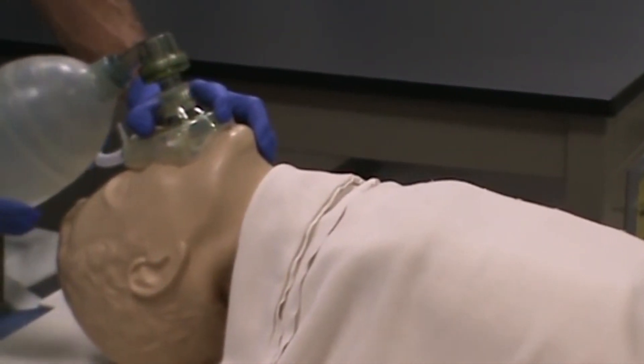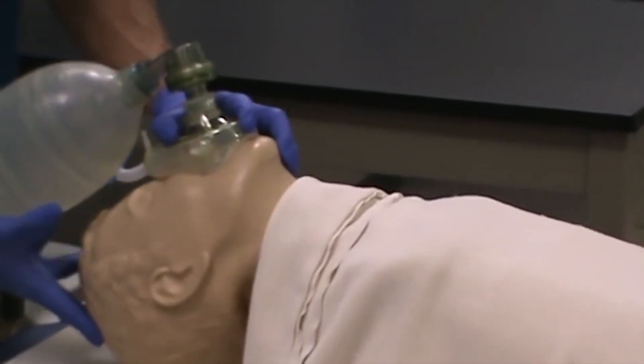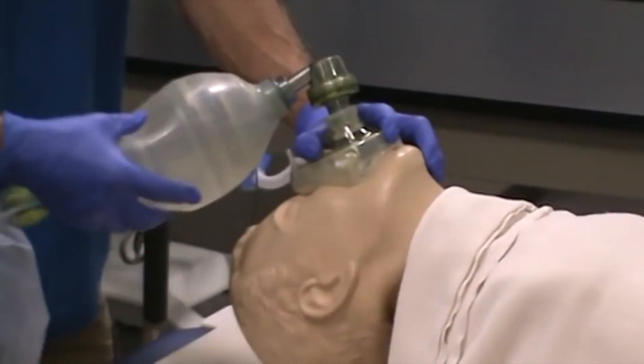If gas wasn't going into the lungs and we don't have an airway in place, what we could do is simply reposition the patient's head and try to ventilate again.